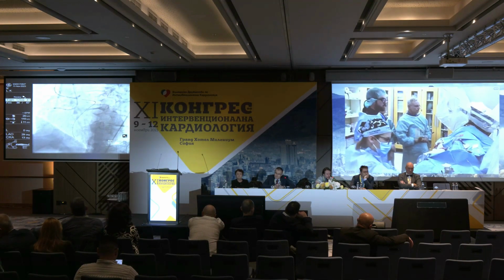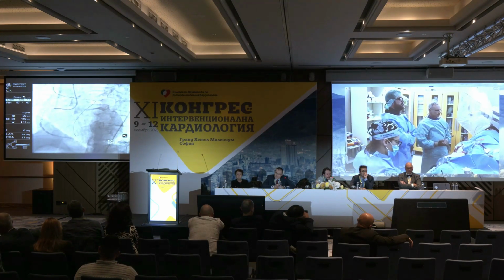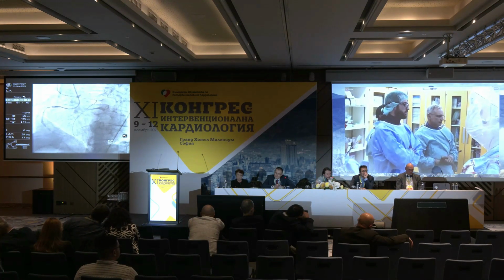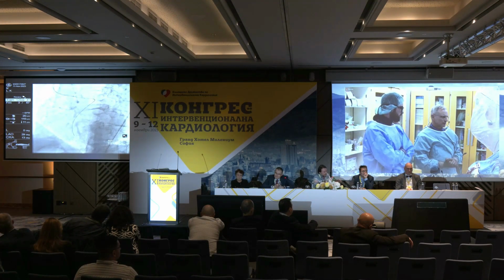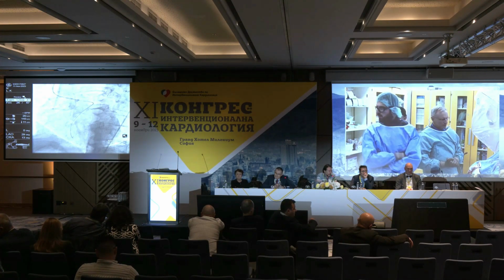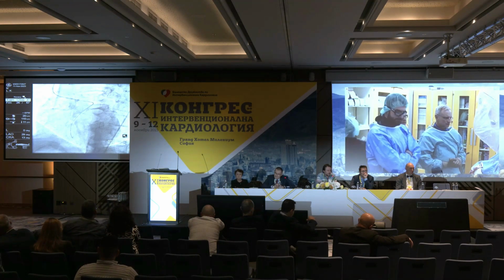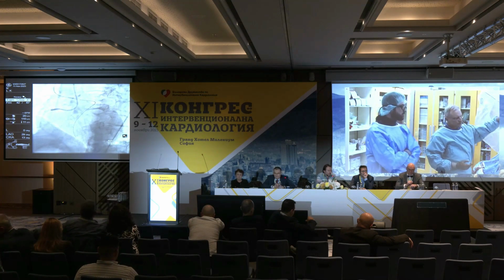For me, we followed the procedure in the way that was most reasonable. We should not rush the retrograde, but we should also not defer the decision making on it too far. And this was a case that, to me at least, was clear after failing to puncture in a reasonable way. I don't say that if I had insisted another 45 minutes antegrade, I wouldn't have punctured, because you can take a dual lumen microcatheter, you can do many more things than we did antegrade. But when the collateral circulation is as good as this one, I think you should not refrain yourself. Yeah, George, but it is still according to the book, you know.